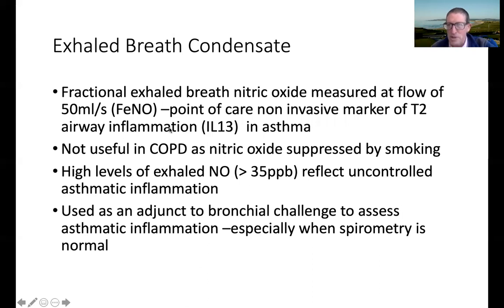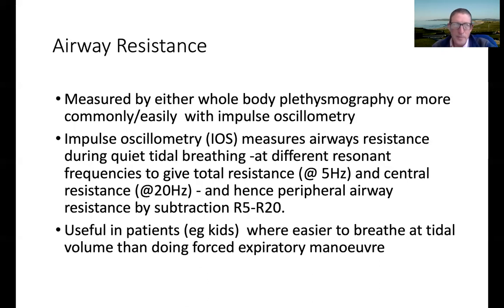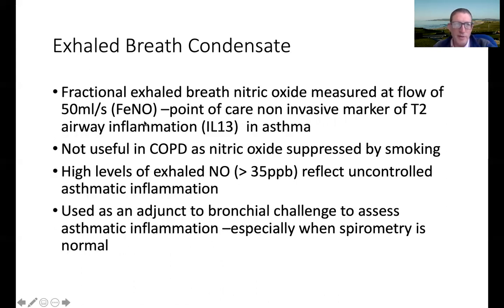So all of my patients in the clinic get spirometry. All of my patients get impulse oscillometry to measure their peripheral airway resistance, and they all get fractional exhaled breath nitric oxide. It's not useful in COPD because nitric oxide is suppressed by smoking. High levels of nitric oxide reflect uncontrolled asthmatic type 2 inflammation, and it's often used as an adjunct to bronchial challenge testing to assess whether patients have got asthmatic inflammation.